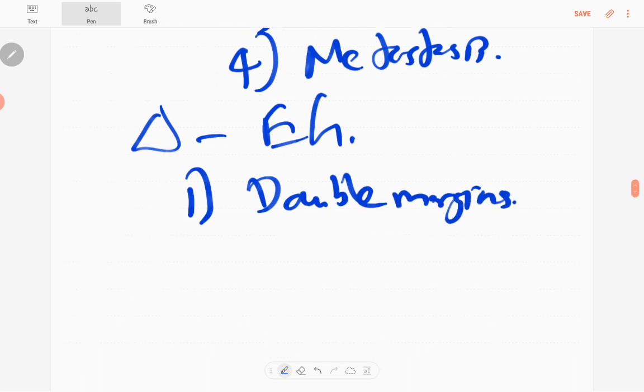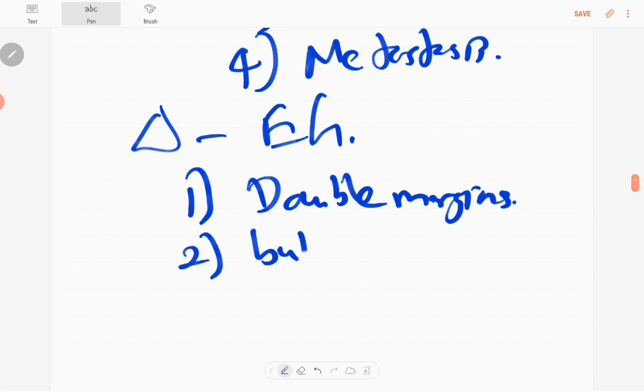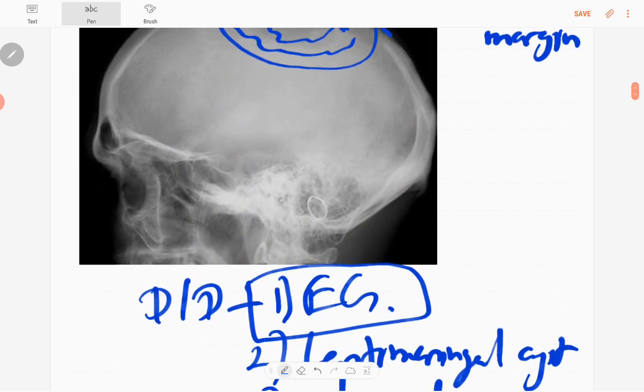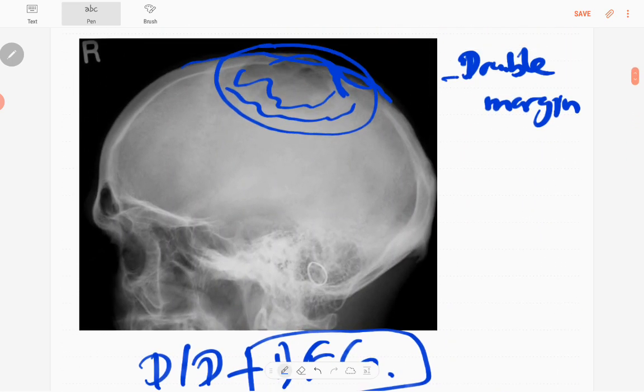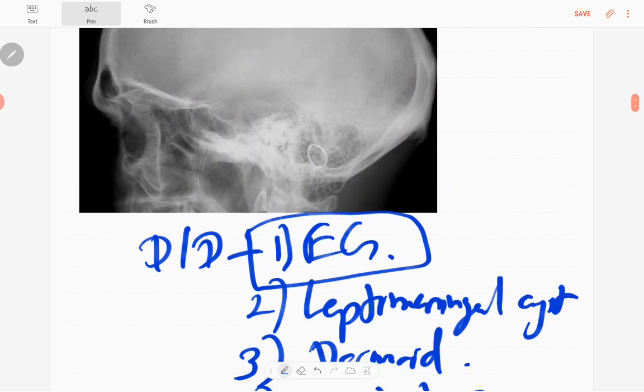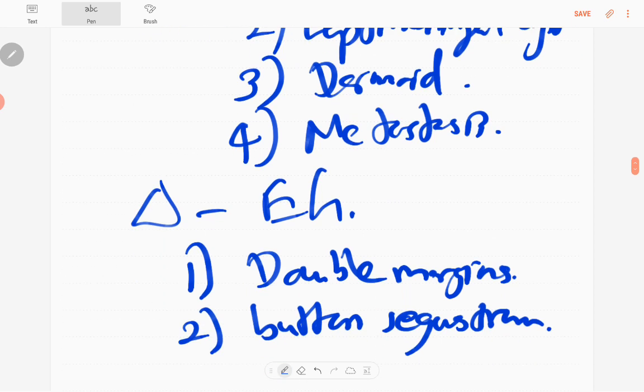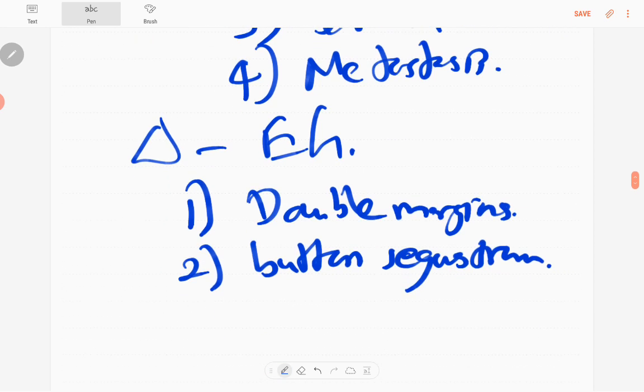The other one is button sequestrum. Button sequestrum is not seen in this one. That means a lytic lesion with central sclerosis, that's the intact bone, button sequestrum.